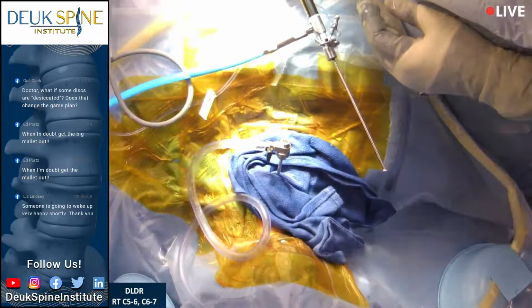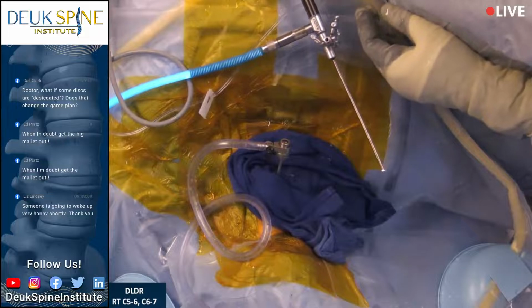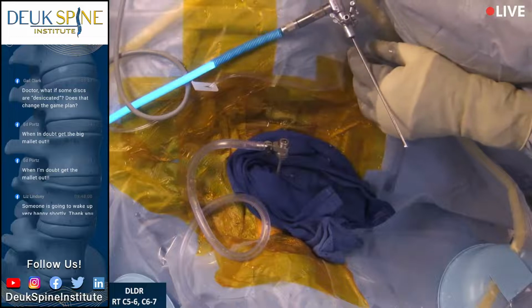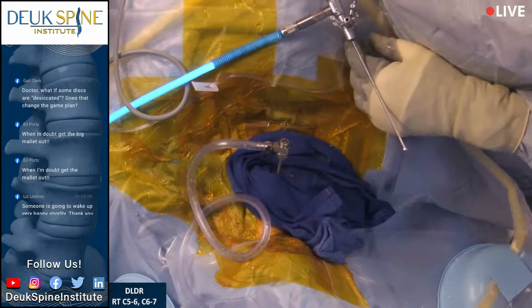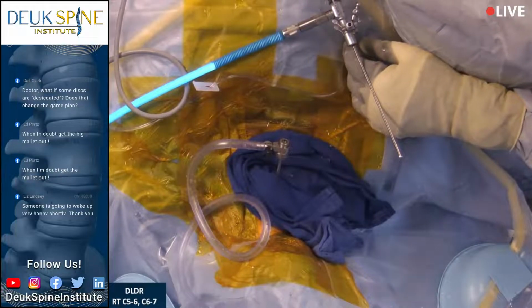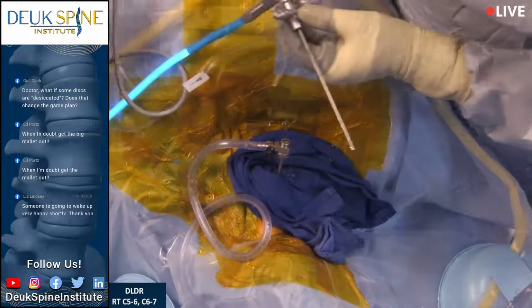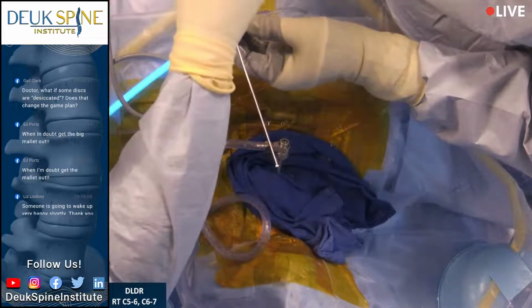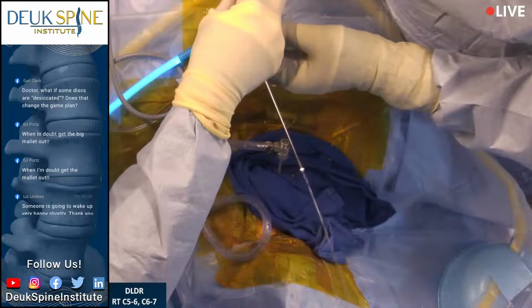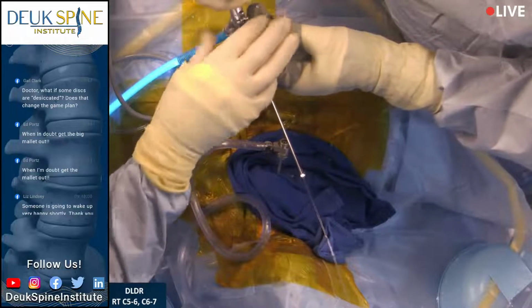So right now, there's a laser fiber and it has a small tear on the side of the blue casing, and it's not safe to proceed with it. So we're going to fix it, and it takes a few minutes to do that, and then we're going to start up again. I'm not going to close the valve, which doesn't allow me to create as much back pressure, which I like. But let's just try it with the valve open until we get the next scope. But definitely we're going to need to get in there.